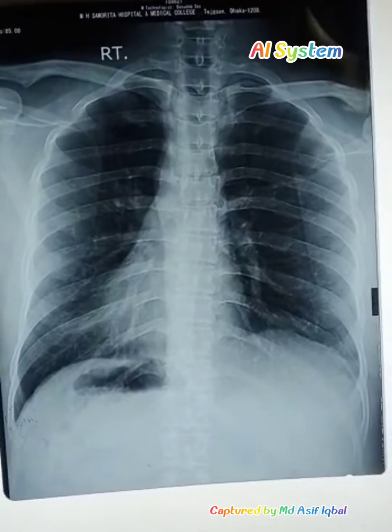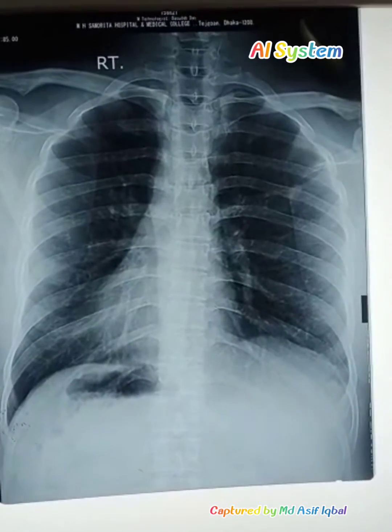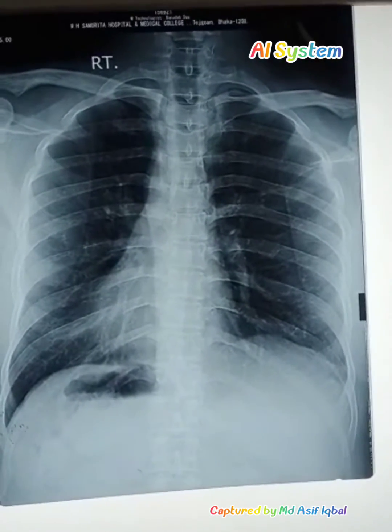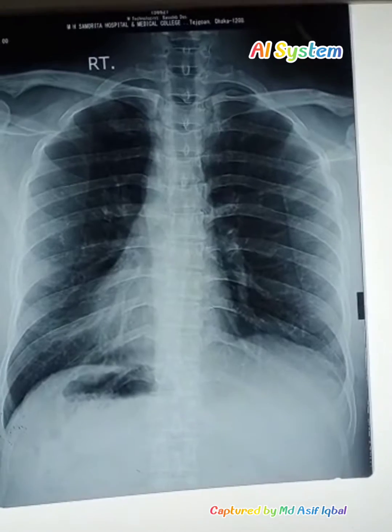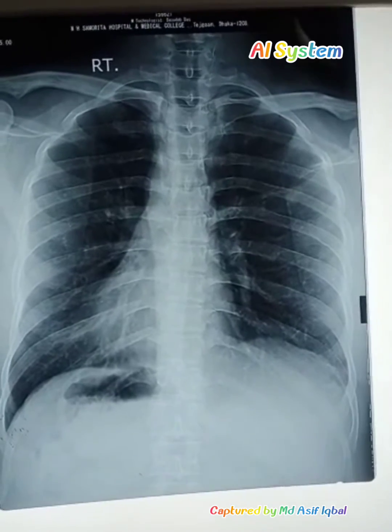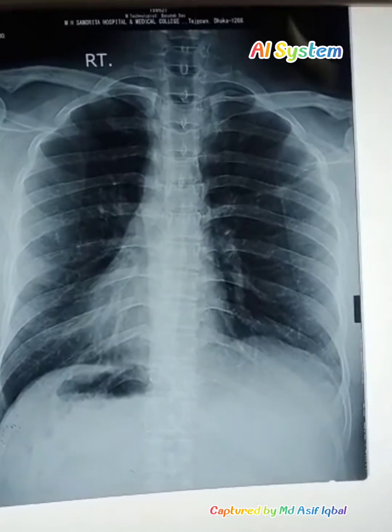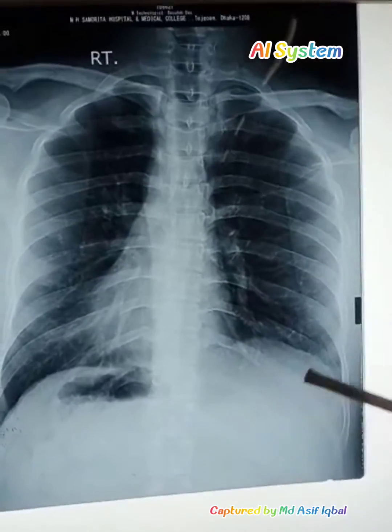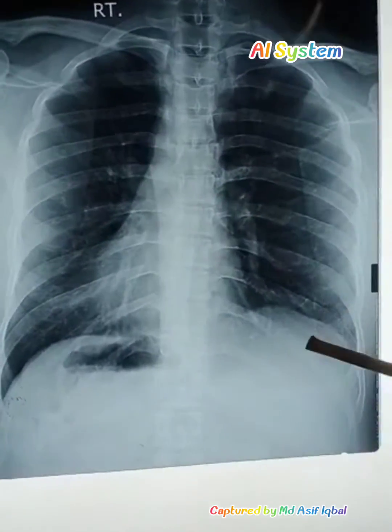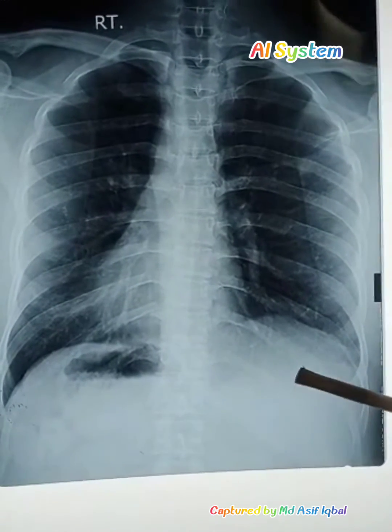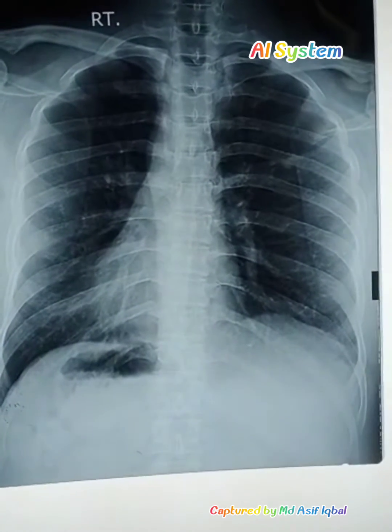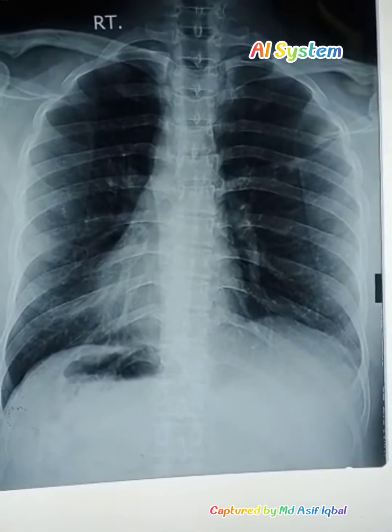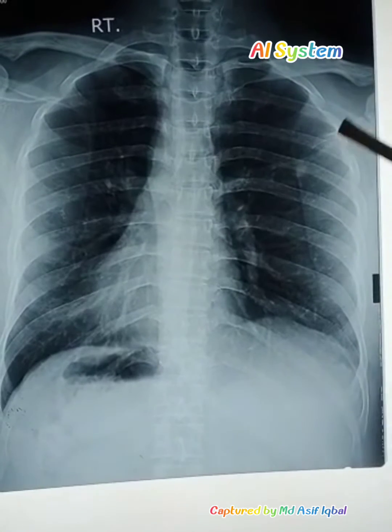Assalamu alaikum dear students. Now we are studying about the X-ray film — the chest X-ray PA view showing the shadows of the heart and the soft tissue structures.